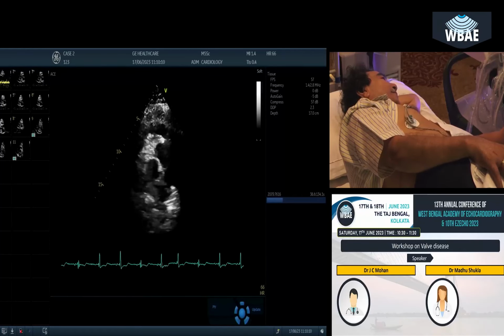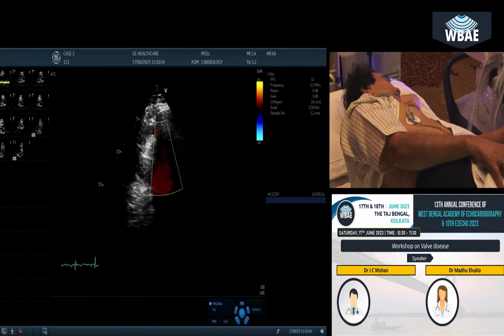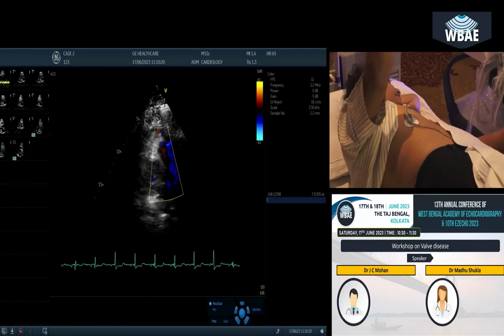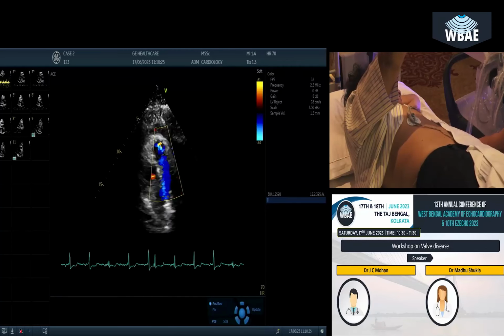All right. So that's the pulmonary valve. You want to do something with the pulmonary valve? You want to tell me how much is the pulmonary pressure, the pulmonary valve acceleration time? Just pulse Doppler at the valve, a little proximal to the valve, maybe a millimeter proximal.